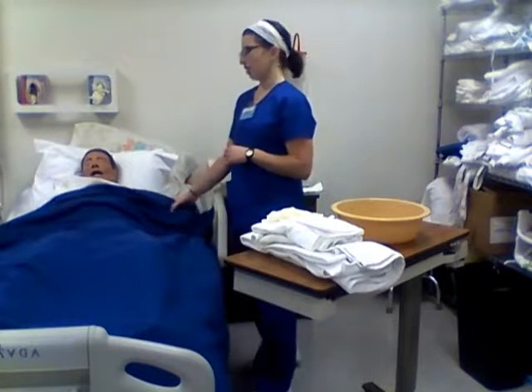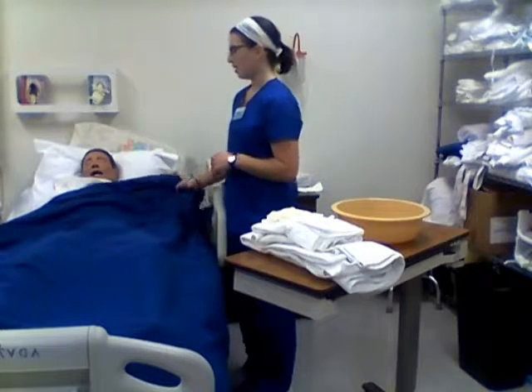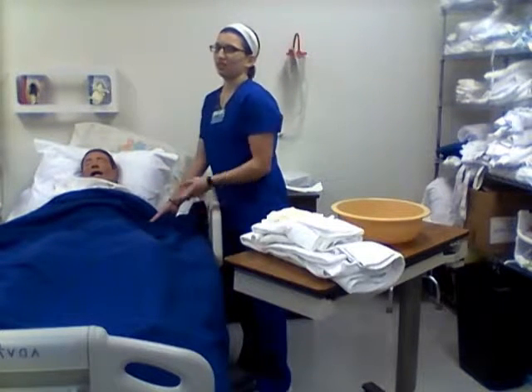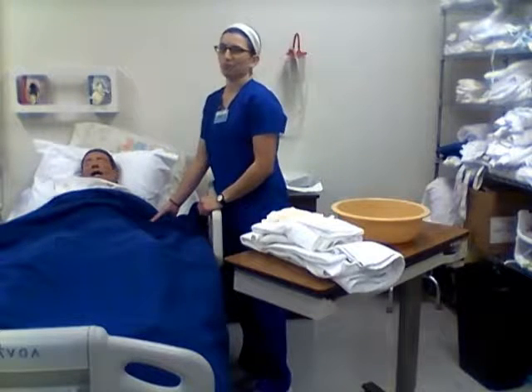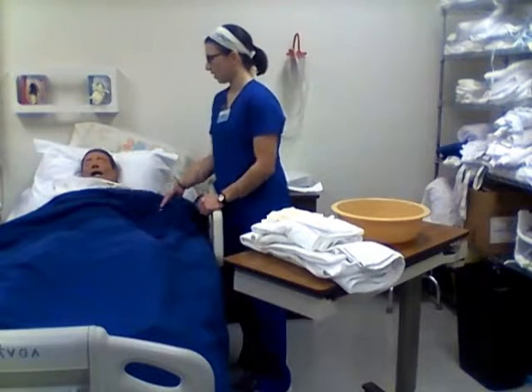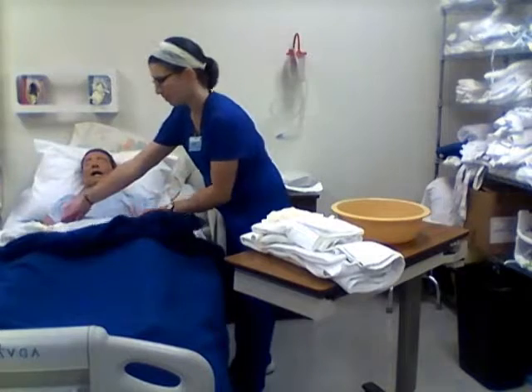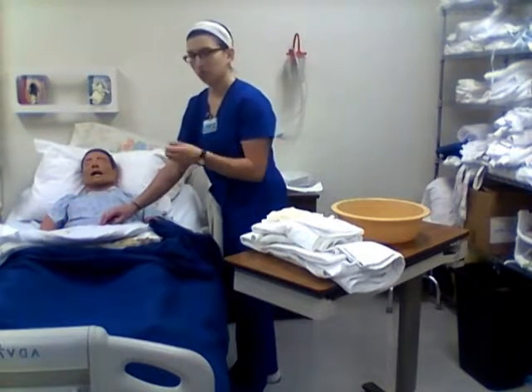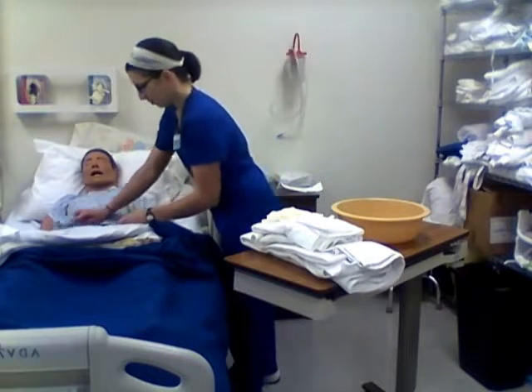And so before we start anything, I'm going to assess for pain. So, ma'am, what's your pain scale today? Feeling okay? And she can tell me her pain scale. She says it's a 4. So now I can go ahead and I'm going to assess her abdomen, make sure that there's no distension, no wounds or anything that would possibly mess up what we're going to do.